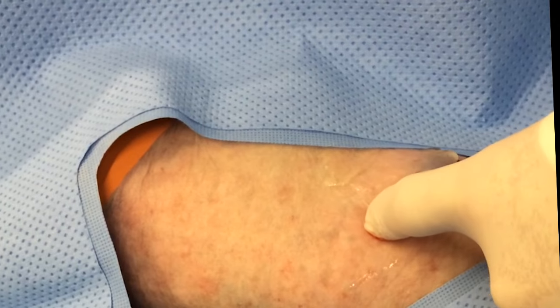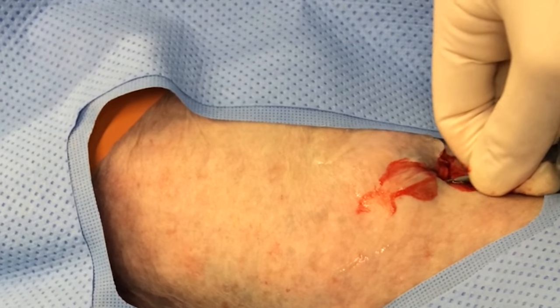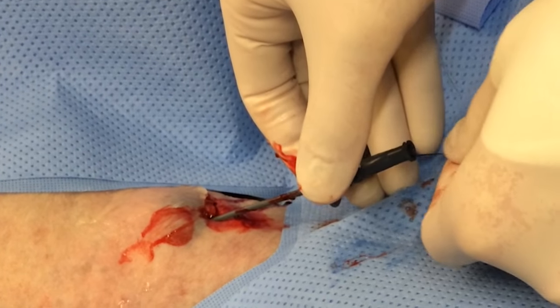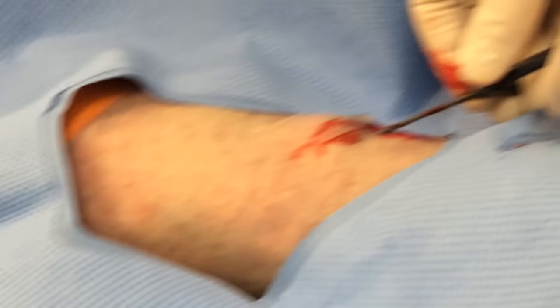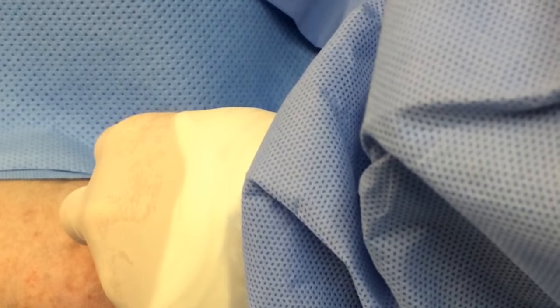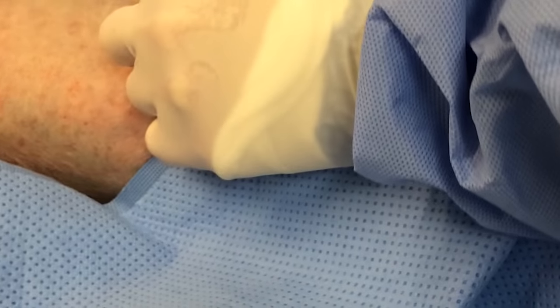He's making a nick over the wire now and he's going to insert the dilator. Now the dilator is big and thick, so you really want to make sure it goes easy. If you're reaching resistance, rack the wire in and out to make sure it's not kinked. When you're actually pushing on the dilator, push right near the skin — don't push far away by that little T-piece. You want to be a couple of centimeters away. He's removing the end of the stylet. You saw that rush of blood — he puts his thumb over it to prevent the patient from exsanguinating.